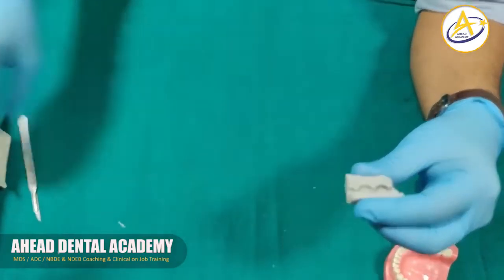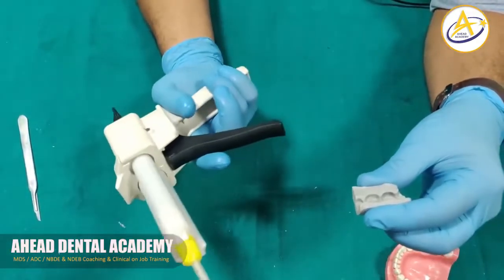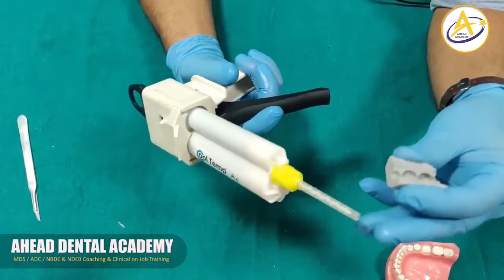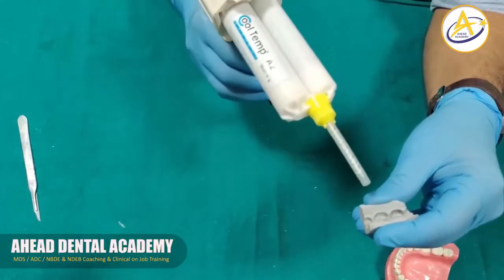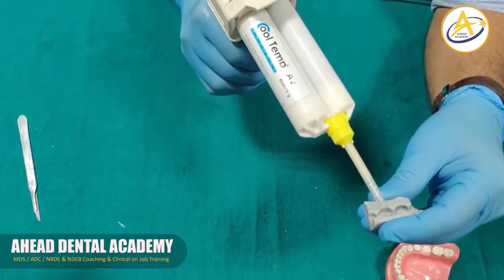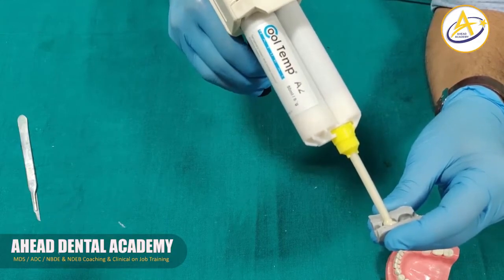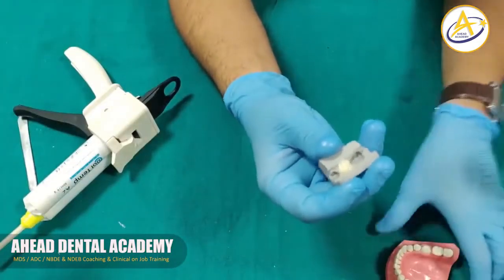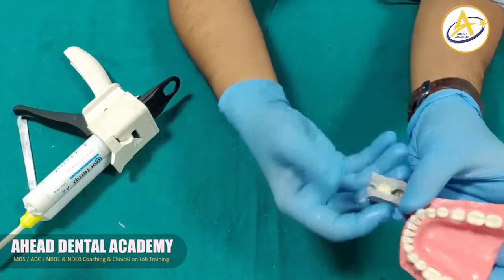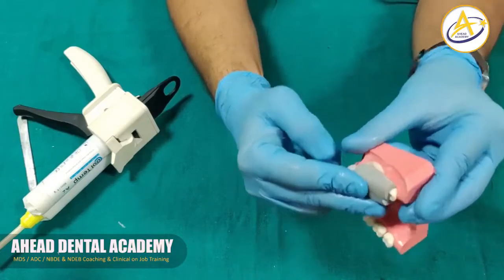Then we fill the tooth that we need to temporize using a bisacrylate material. This is a bisacrylate material which is supplied, and we use a special gun to inject this material in the area of our temporary tooth. We slightly overfill the material, and then we seat this index over our prepared tooth.